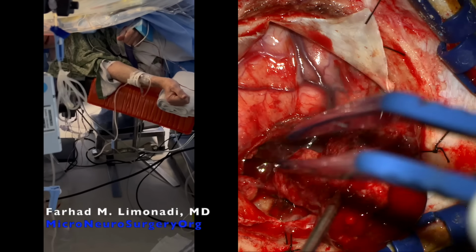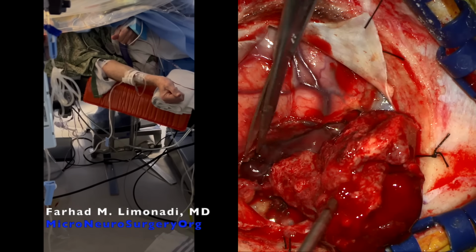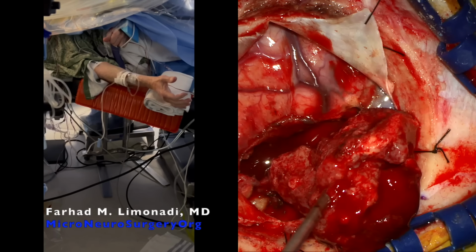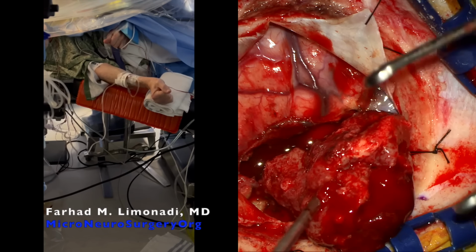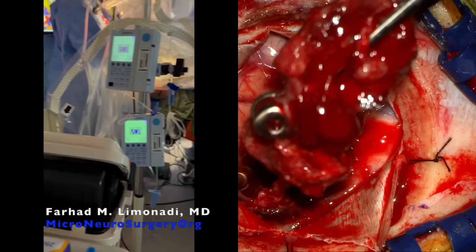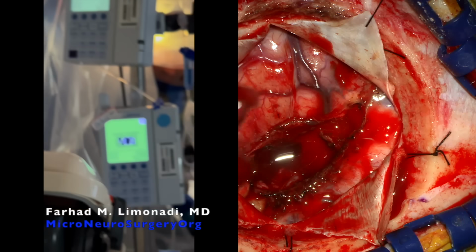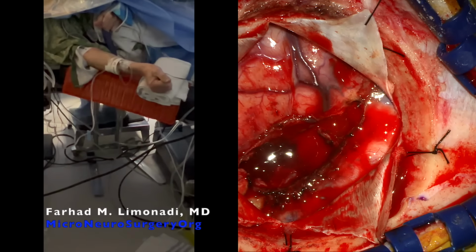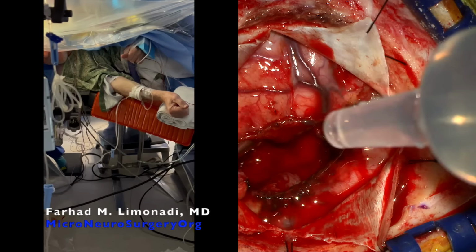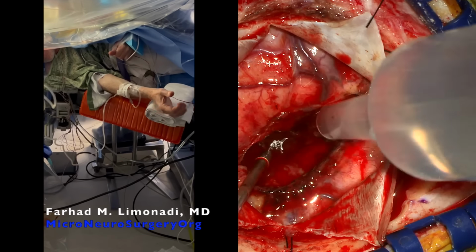Several vascular supplies. And the scissors? Ready. Can you open and close your hand? You're doing awesome. You see a big vascular? Thank you. And this is big. Okay? Go. And ball irrigation, please. Can you open and close your hand? Very good. Moving? Yes. Good.